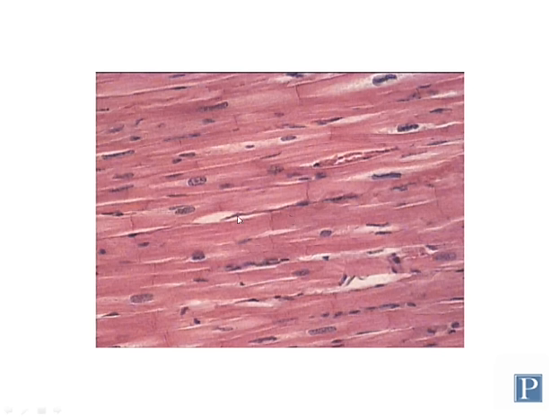And cardiac muscle is more similar to skeletal muscle than smooth muscle, but it does have some differences as well. So the structure of the contractile filaments is very similar to skeletal muscle. These cells are also long and not tapered as they are in smooth muscle, but they're not nearly as long or as large in diameter as skeletal myofibers. And another difference is cardiomyocytes typically only have one or two nuclei.